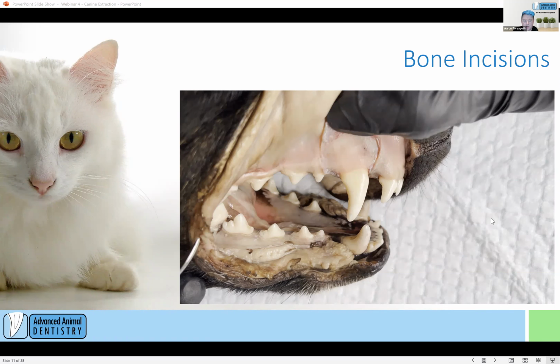So yeah, we do those 3 cuts, and certainly the mesial and the distal cuts also perform another function. It is removing the attachment of this buccal bone plate, labial bone plate, from the skull, but also, they actually are deep. After the video, there's a quick diagram I did up this afternoon that I hope shows what we mean, but the incisions are made to the depth of the thickness of the tooth, if you get what I mean. They're going to go down to the other side, to the nasal side of that tooth. Not into the nose, hopefully. Almost start to wrap around that palatal surface. So it allows you to wedge your elevator in and hook it around the back of the tooth to lift it up towards you.